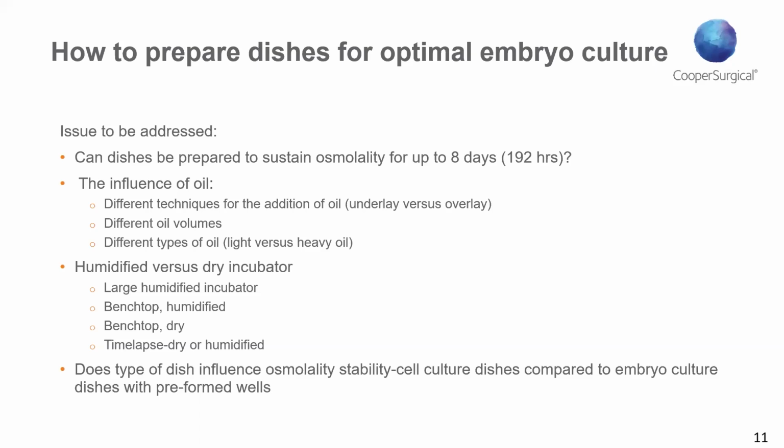So we've got some challenges. We need to have a very robust SOP to help us with dish preparation, and we need to stick to it. And when we look into labs and look at their protocol drift within their SOPs, we often find that the area that we see most drift is within dish preparation. So it's important that the SOP is robust, and it's important that it's adhered to during the whole procedure and not cut corners to make our lives easier, but make the lives of our embryos much more precarious.